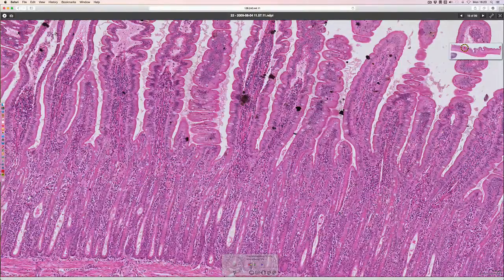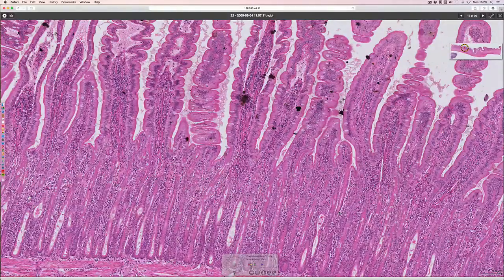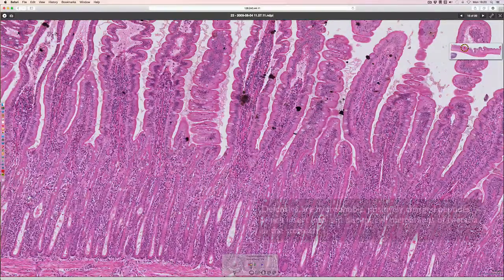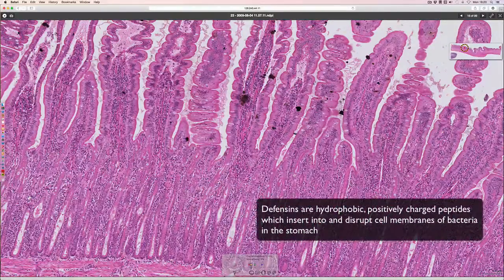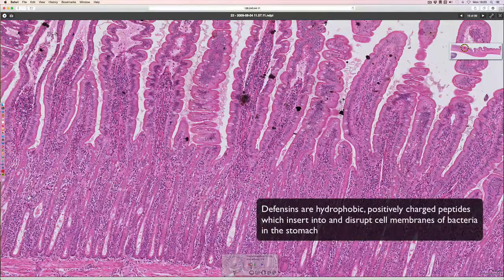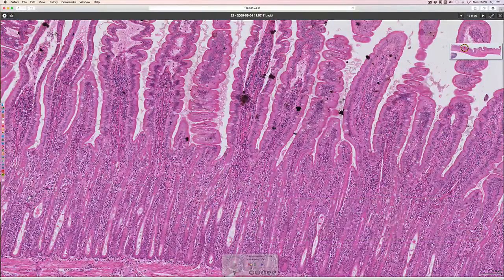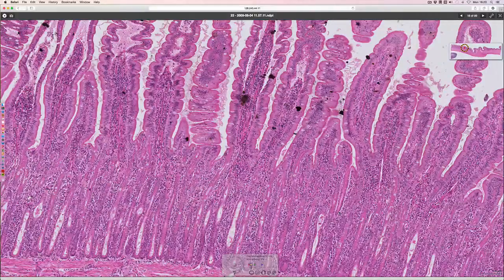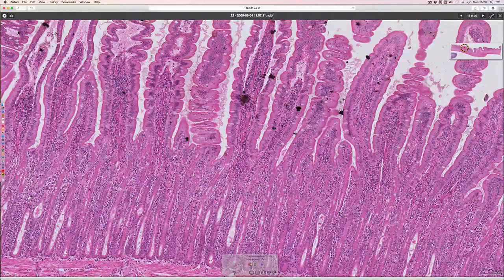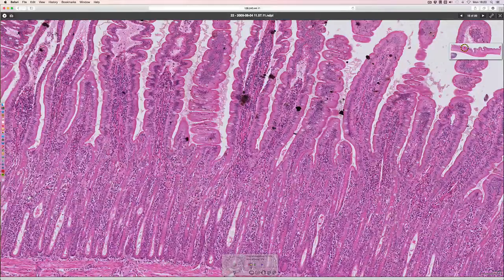Down at the bottom you will also find Paneth cells, which are involved in producing defensins. So between the stem cells, the goblet cells, the enterocytes, the Paneth cells, and some enteroendocrine cells as well, there are quite a variety of different epithelial cell types in the small intestine.